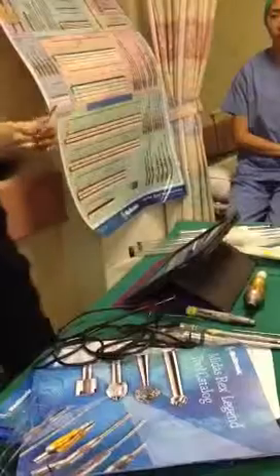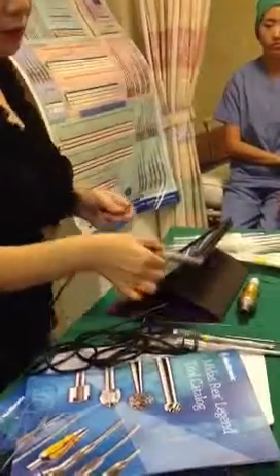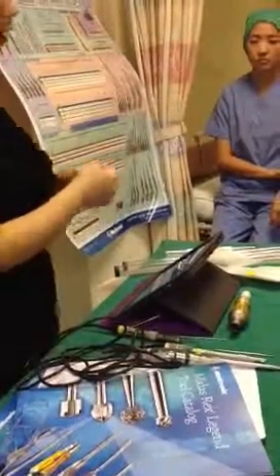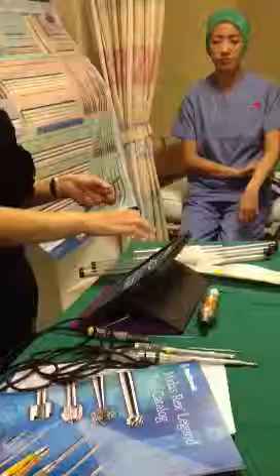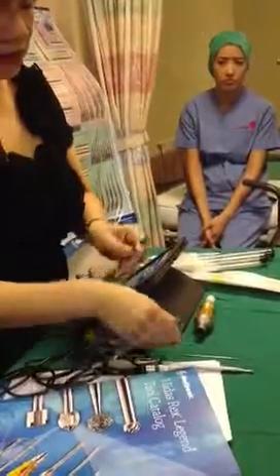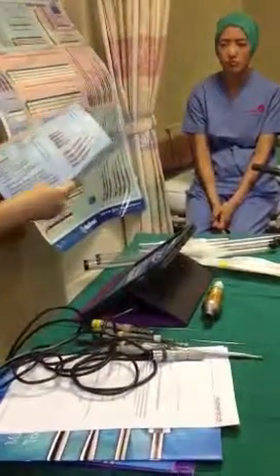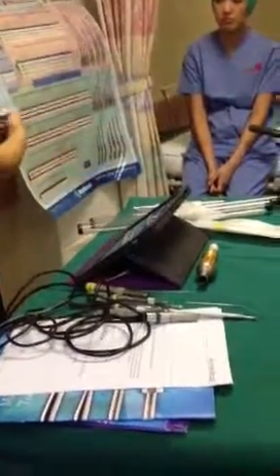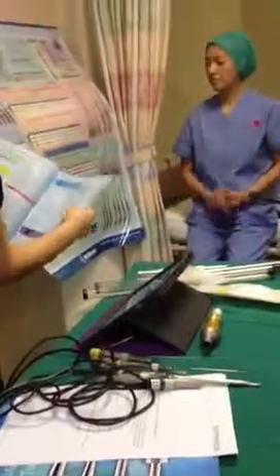We don't want blood stain or debris to be trapped, because then it forces the drill bit, and sometimes the debris might get stuck in an area where you can't clean. So we are going to encourage putting every brush in the sterile area. We have 3 different brushes, 1.2, 2.4 and 3.2, because different attachments have different diameters. Small bore, like the telescopic, of course uses the 1.2, and then you can see the large bore. Over there you can also see the bore sizes.